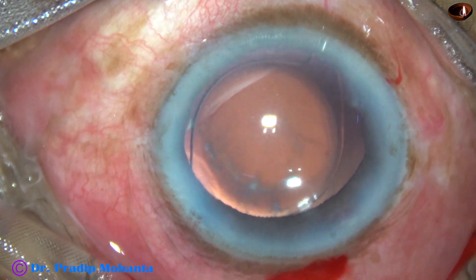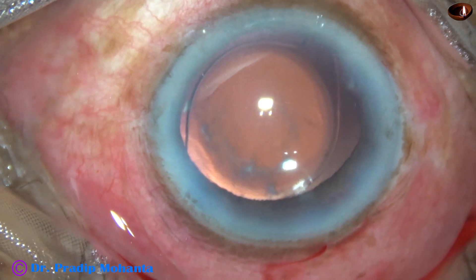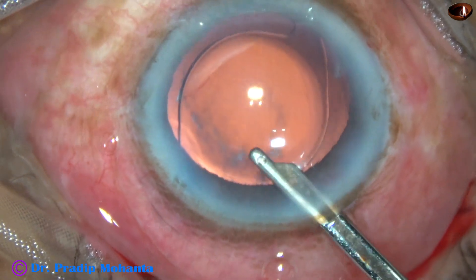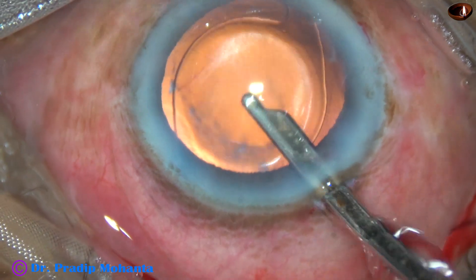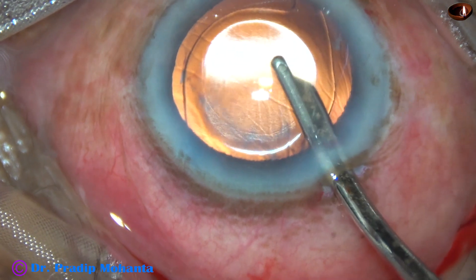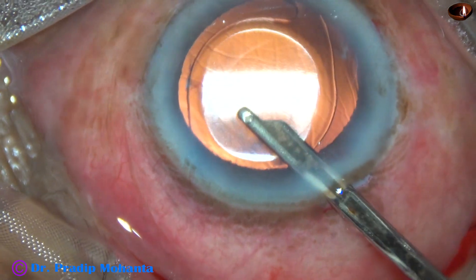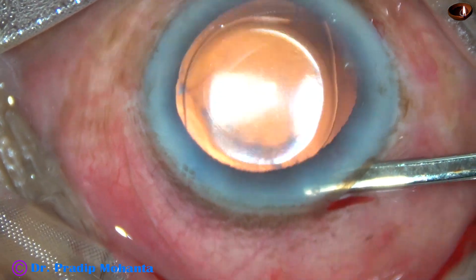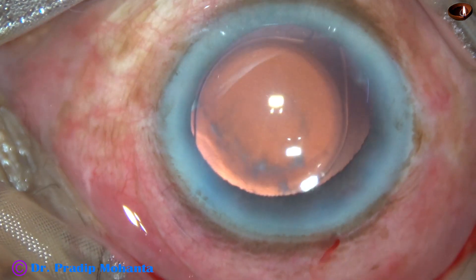And now the side ports are closed by hydrating the corneal stroma on either side of the stab wounds. This is the final lavage of the anterior chamber — all the visco is removed, and then the anterior chamber is nicely formed. And the case is concluded.